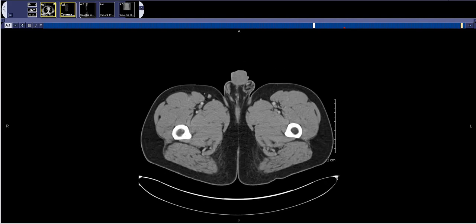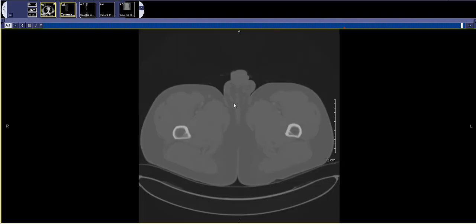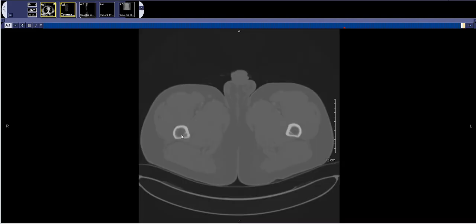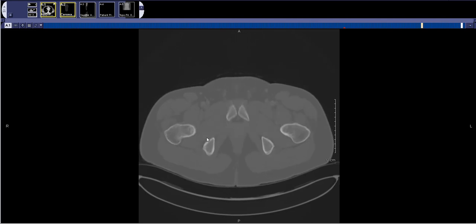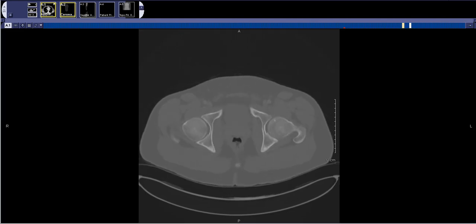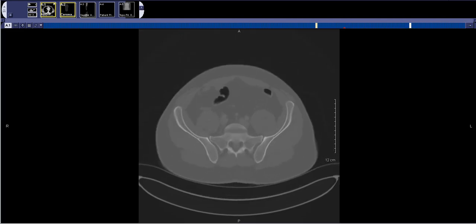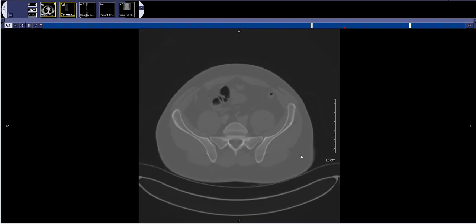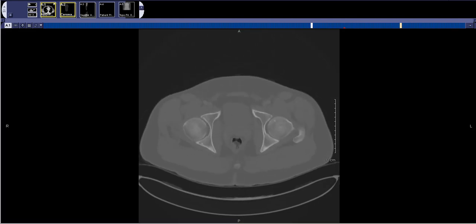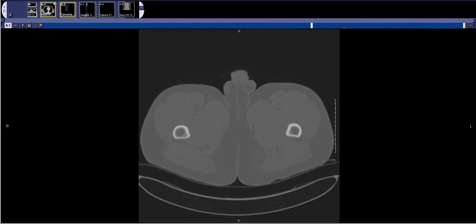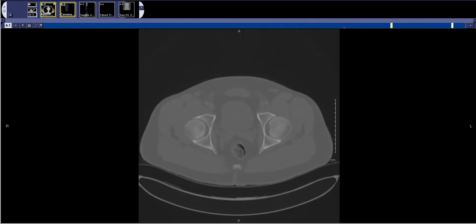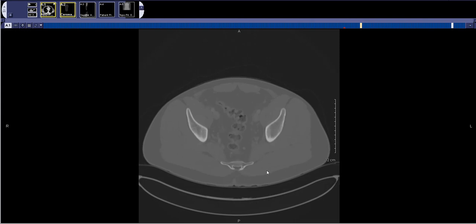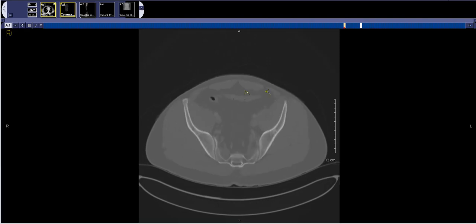First I look at the right hip and right pelvis, then come down through the left pelvis and left hip. Then I start looking in the midline — the pubic symphysis — then down to the sacrum.